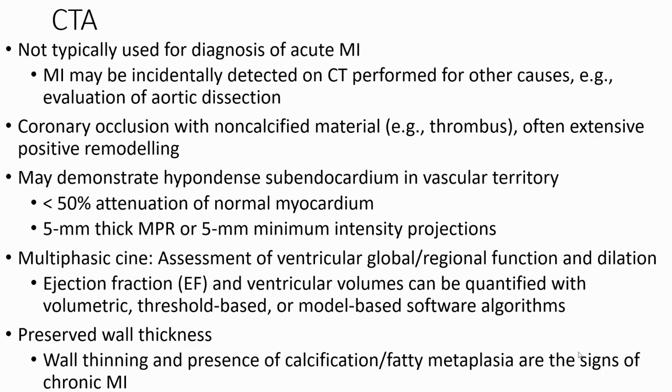In CTA, it is not typically used for diagnosis of acute myocardial infarction. Infarction may be incidentally detected on CT performed for other causes, for example, evaluation of aortic dissection.